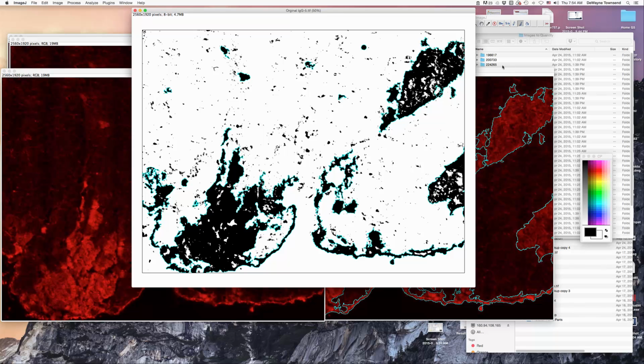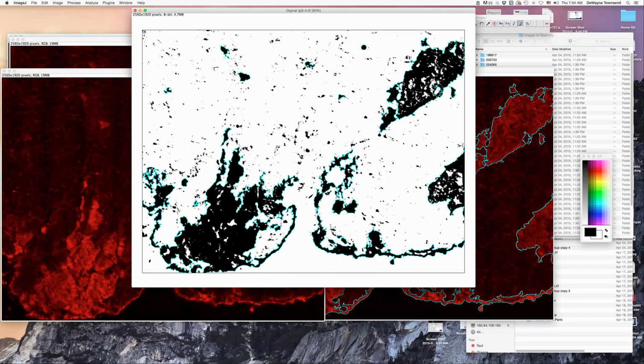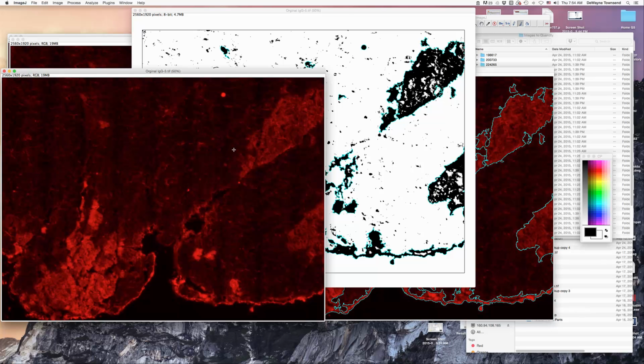These are probably different and appropriate. So I don't know. Let's see about this one here. Look at that. I'd probably say that this one here should be included in the lesion. But I'm okay with this one not, because it does look like it kind of works down, and that could be a myocyte in there that's holding out and isn't damaged. So then you've got this area here. That looks good. Yeah, I'd say that's reasonable, right?